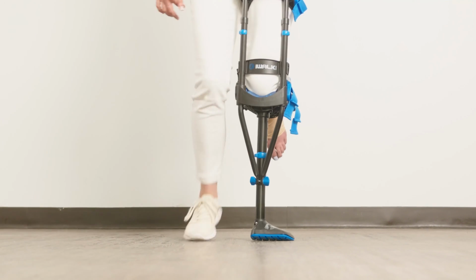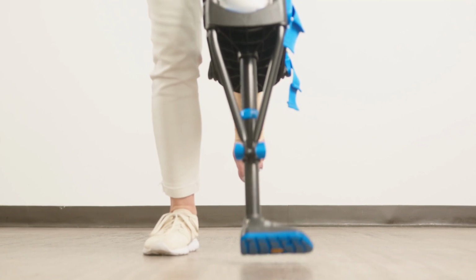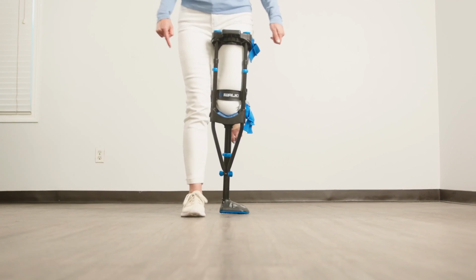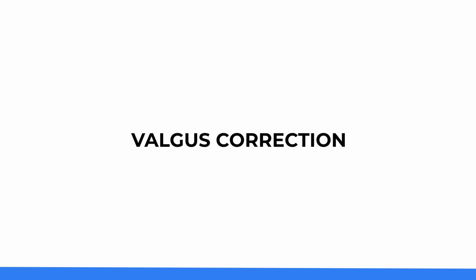Valgus or varus correction. When standing or walking, the entire width of the tread should be in full contact with the ground. Walking on the outer or the inner edge of the foot makes walking more difficult. This happens because the patient needs additional adjustment to compensate for valgus or varus leg geometry. Valgus or varus compensation is done by adjusting the thigh supports.